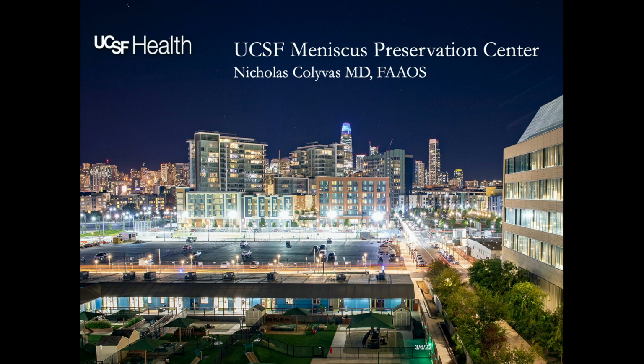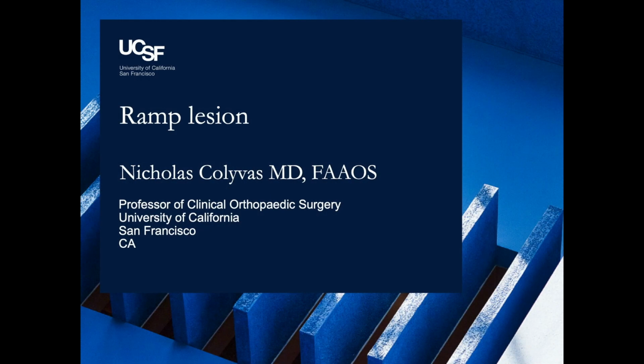I'm a professor of orthopedic surgery at UCSF, and I'm the director of the UCSF Meniscus Preservation Center. Today I'm going to talk a little bit about ramp lesions and show an illustrative case.